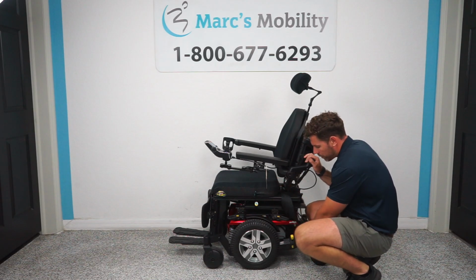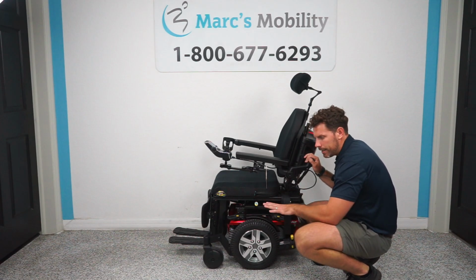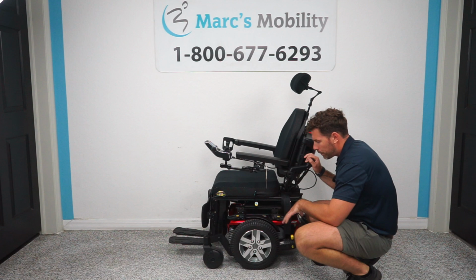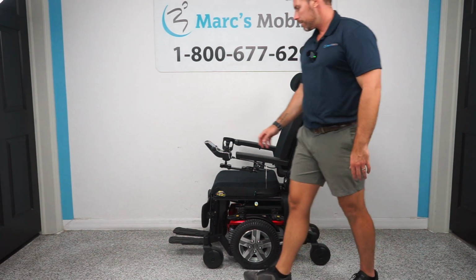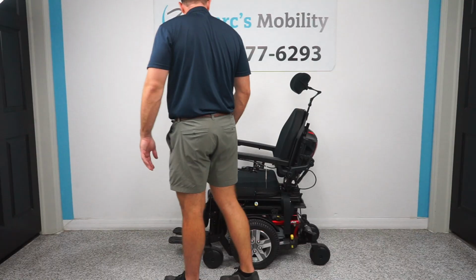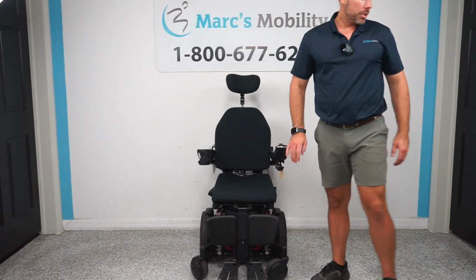You do have 2 motors on the unit, 1 on each side. If you were to push this yellow lever down, it's going to disengage the motor. Do it on both sides, and then you can put this in freewheel to be able to push the chair around. There are many other adjustments on here, as on the arms as well, but I'm going to go ahead and turn this forward and just give you the current configurations on this chair.